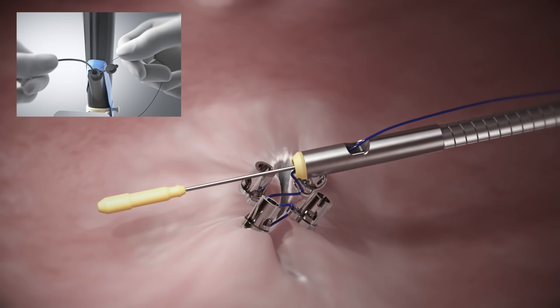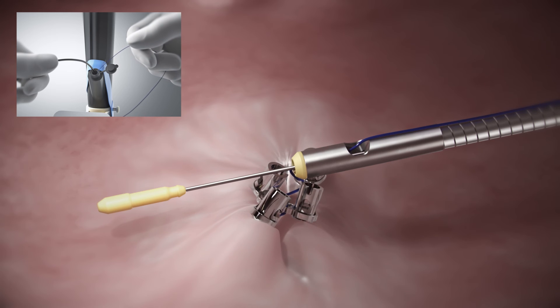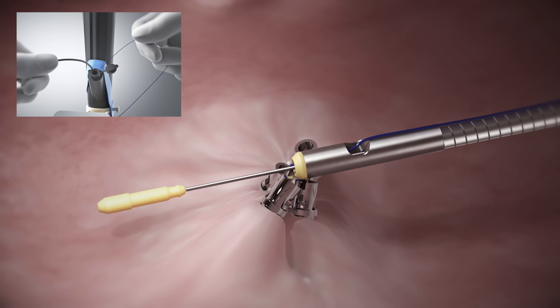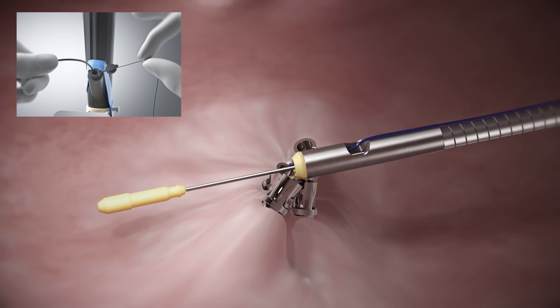While holding the cinch catheter in place, apply tension to the suture until the helix TAC and tissue has been approximated. Care should be taken not to pull the suture too tight, resulting in breakage. Prior to deploying the cinch, hold suture tension gently — grasp between thumb and pointer finger, allowing the suture to slide.